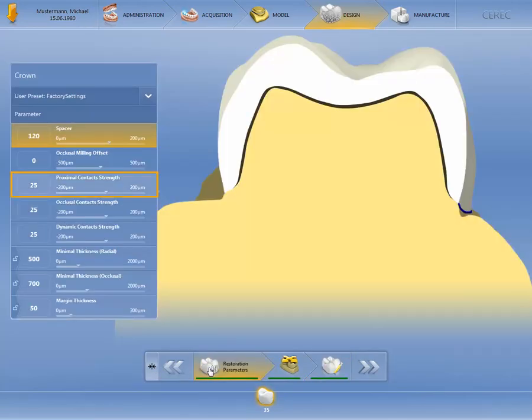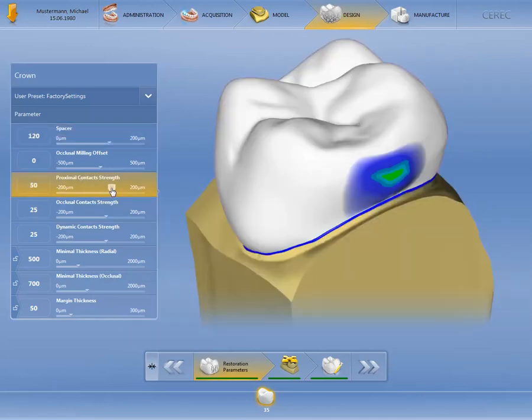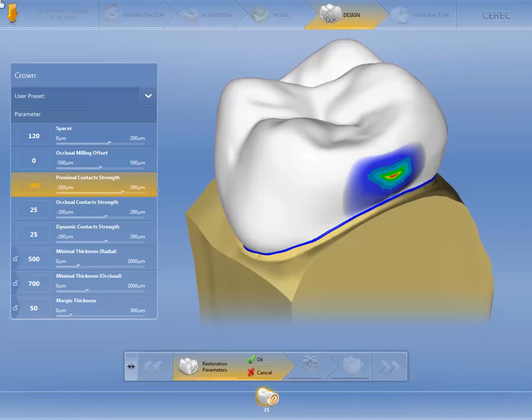For example, let's change the setting for the proximal contact strength. After confirming the entry, the CEREC software calculates a new restoration suggestion.